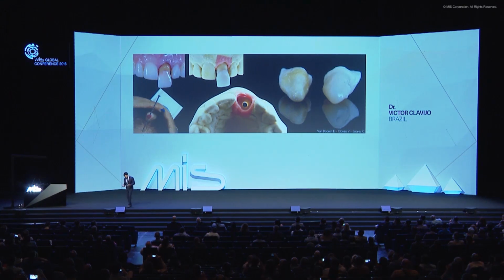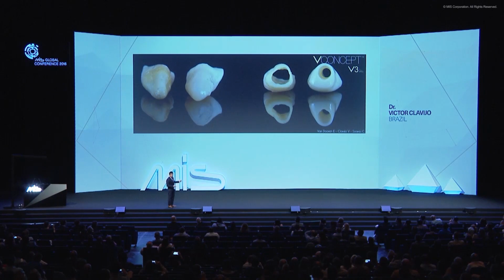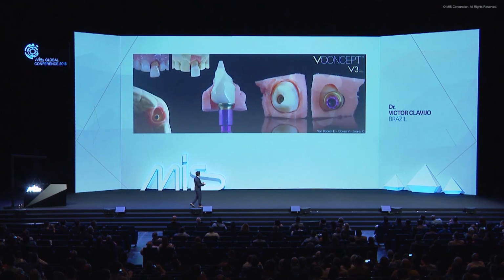And I know that this is a little bit difficult for us, no? It's too much work. But this is an analog protocol that we have been working with, and now I think Eric can explain later, because now we start to work with CAD/CAM, and also we can mill our abutment, and if you compare our abutment in the alveolar model, it's an almost ideal situation.